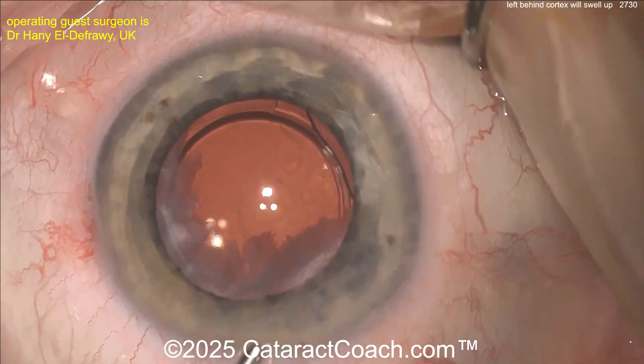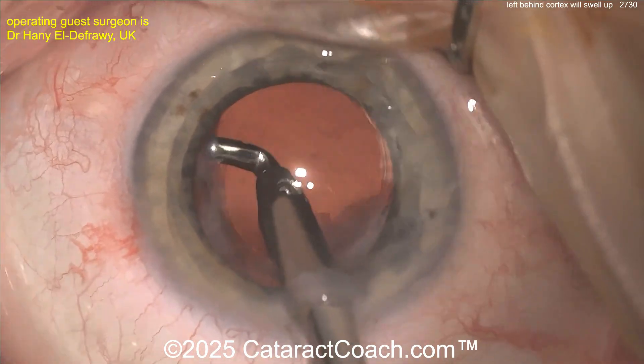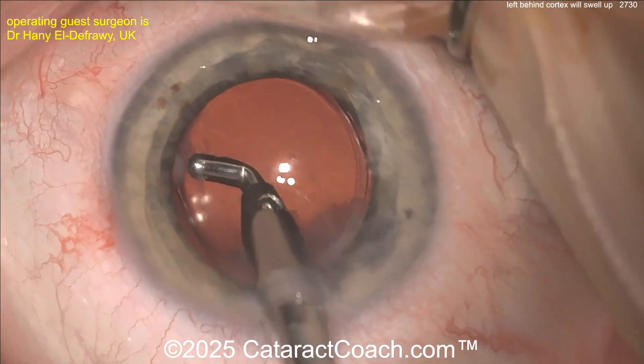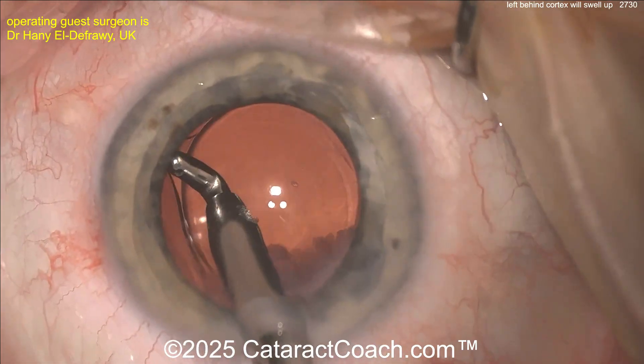It's not always the surgeon's fault — sometimes you get patients with really weird anatomy and you can't get all the lens material out. Sometimes you get patients where you don't see all the lens material, or sometimes it gets hidden. You can hear the IA probe now going in and cleaning all this out.